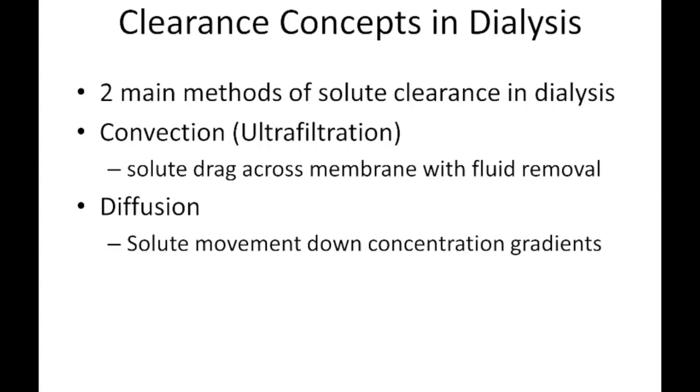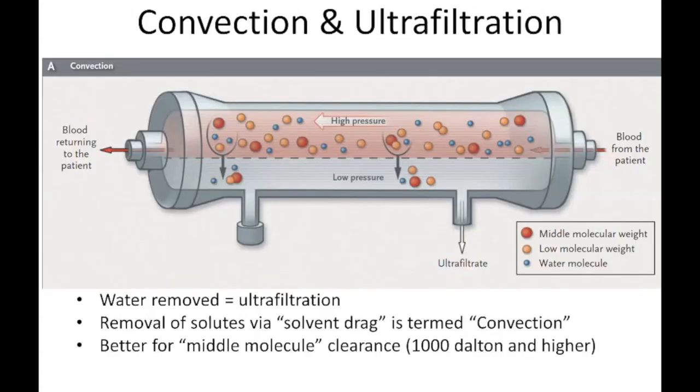And when we remove fluid, that tends to drag solutes across. The other one would be the classic high school chemistry concept of diffusion, which is just solute movement down concentration gradients, and in our case, across this permeable membrane. And those are the 2 major clearance techniques. And you can employ both of those in CRRT simultaneously or separately, and both will produce good effect.